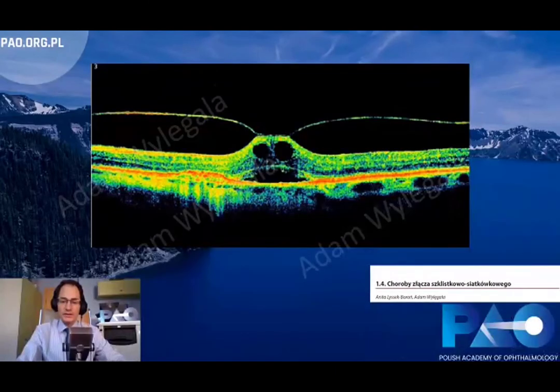So far, we've just seen floaters, we've seen PVDs, whether incomplete or complete, but right now this is going to be more a cause of vision loss. So the incomplete PVD that's causing a tractional macular edema here, right? So we have the traction and they are tearing up the retina.